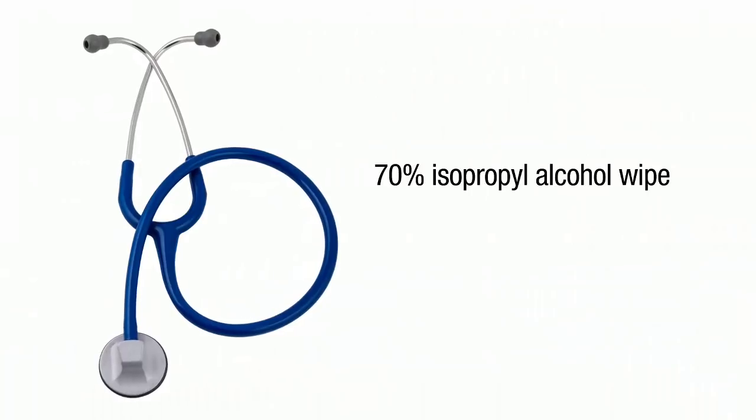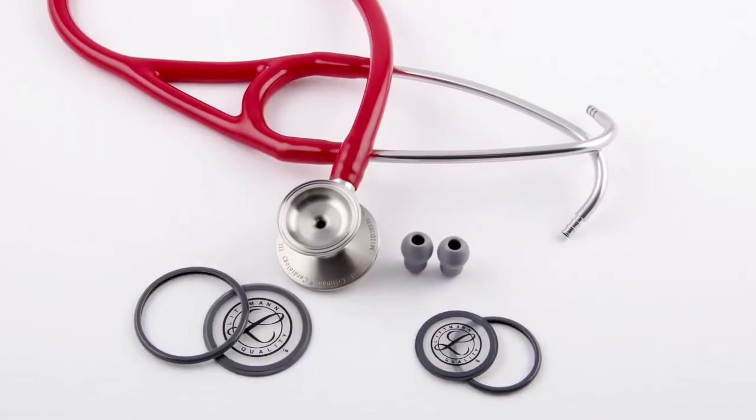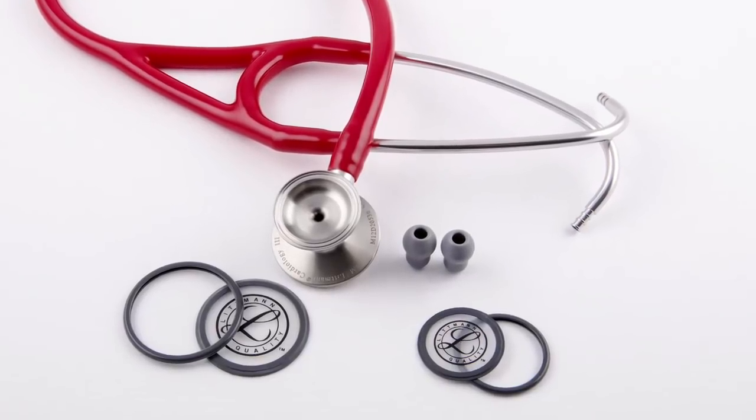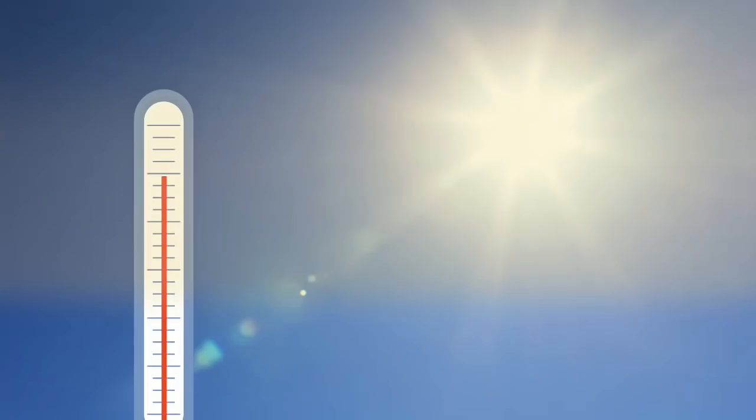Clean your stethoscope after each patient examination with a 70% isopropyl alcohol wipe or soapy water. For a more thorough cleaning, you can remove the rim, diaphragm, and ear tips. To help extend the life of your stethoscope, avoid storing it at extreme temperatures.